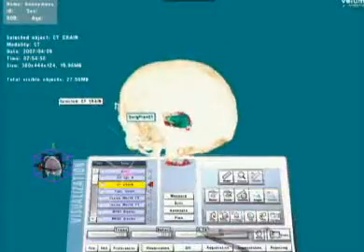Now again, I'll be the first to say that these cases from a technical standpoint are not particularly challenging, but again, with the short development pattern that we were dealing with, it was relatively difficult to wait until something really complicated came in. So what we're dealing with is relatively simple operations in terms of these initial two procedures. Here we have this case.